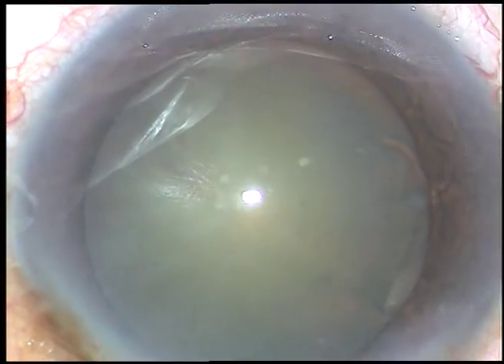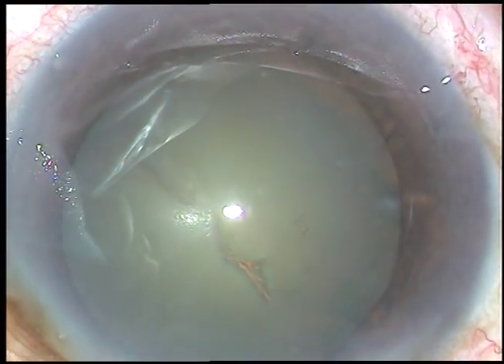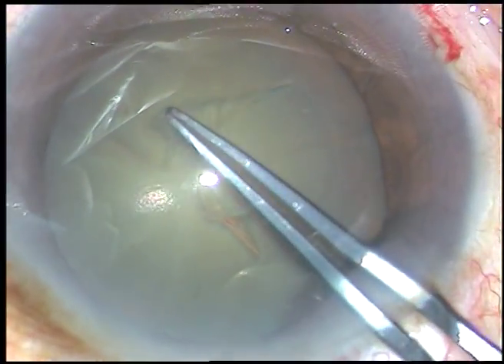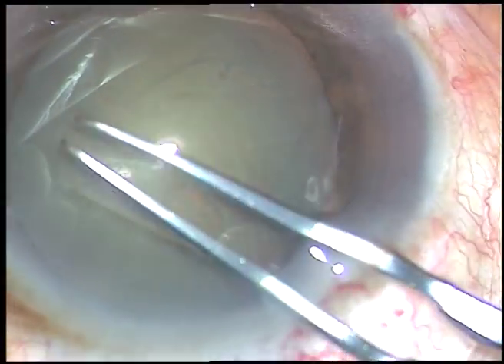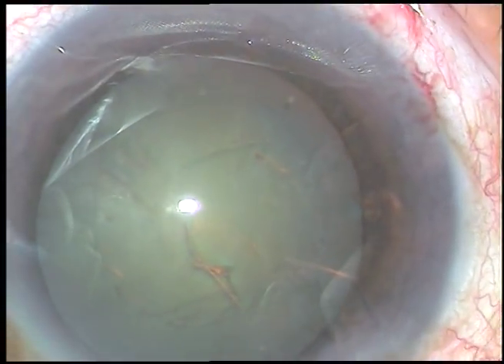I usually take a 26-gauge needle, incise the capsule and raise a big, nice-to-hold capsular tag. I hold this tag and go anti-clockwise. From 4 o'clock, suddenly it came towards the center and the rexis became quite small.